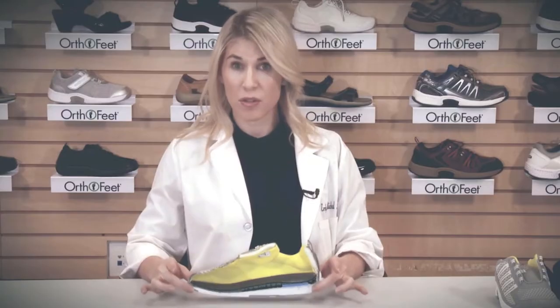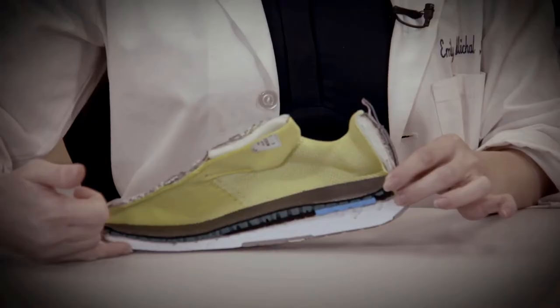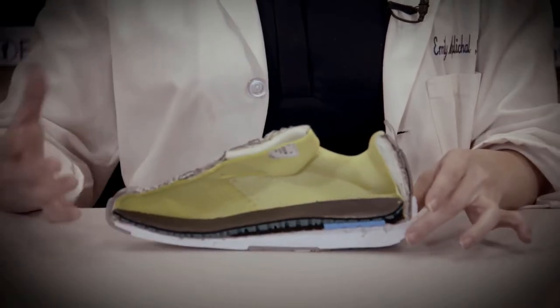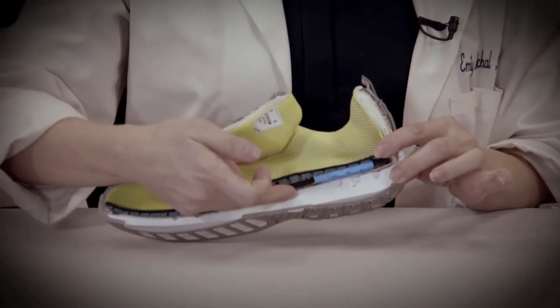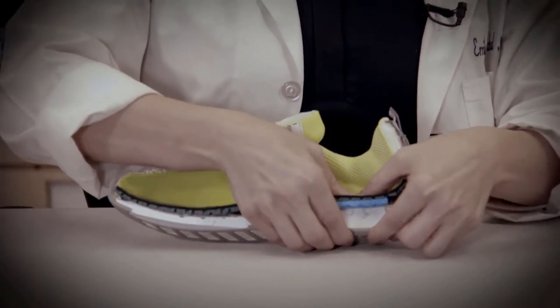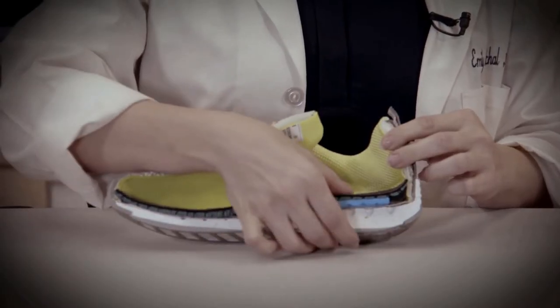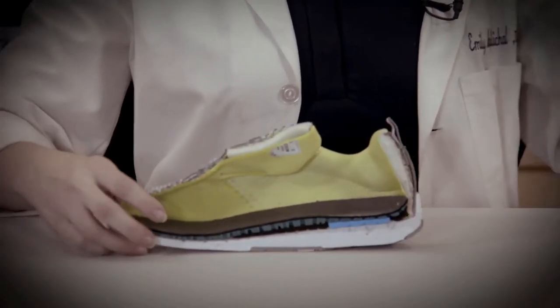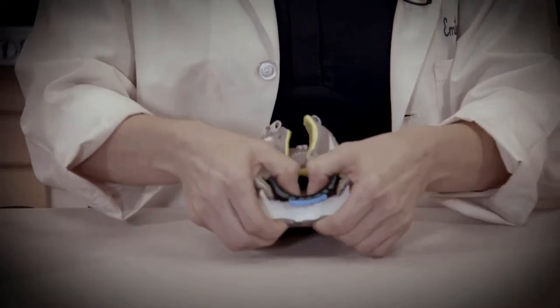All OrthoFeet shoes are designed with a lightweight, cushioned, ergonomic sole. This is featured with a heel-to-toe drop, which provides a mild rocker effect. This increases the ease during walking, which is especially important if you have arthritis. Another feature of the OrthoCushion system is that it provides a cushioned effect to the heel, which is important if you have plantar fasciitis or want to absorb excess impact forces. This OrthoCushion system is available in all of the shoes, from the athletic shoes, with cushion in the sole and the insole.